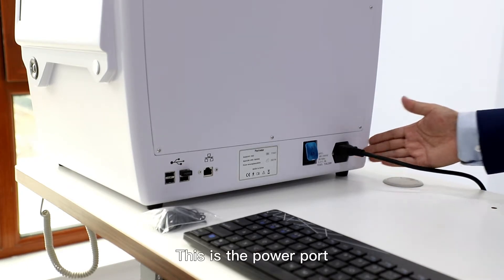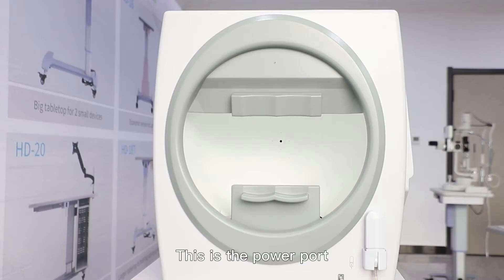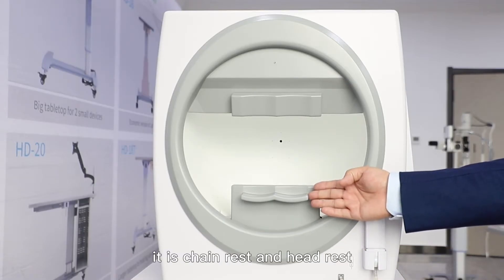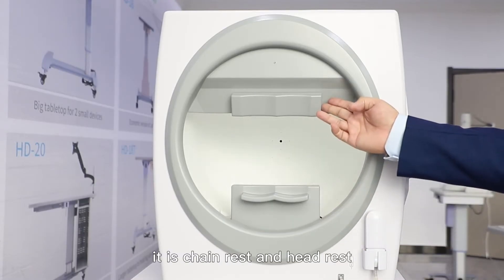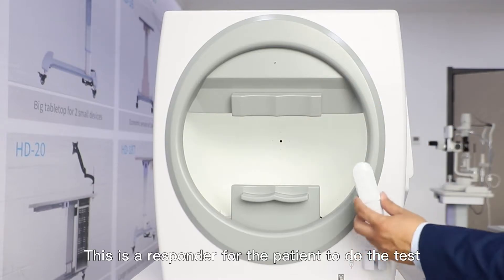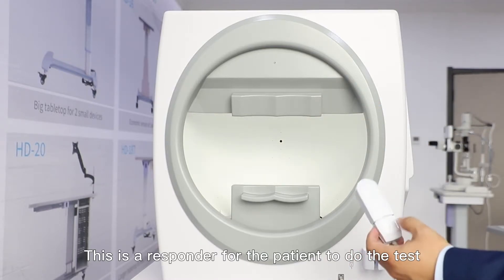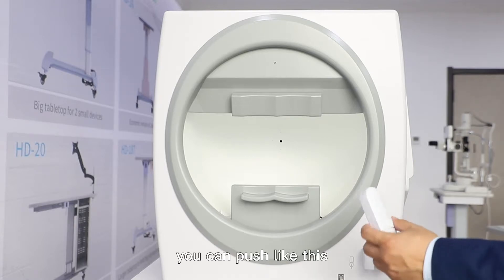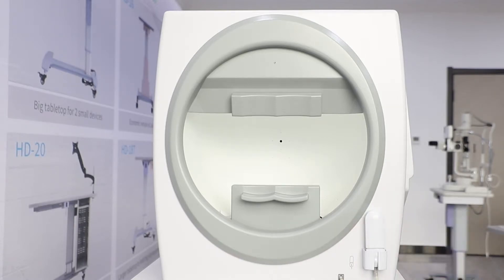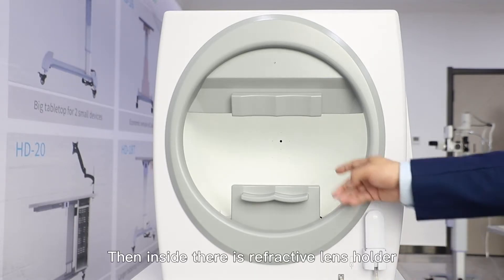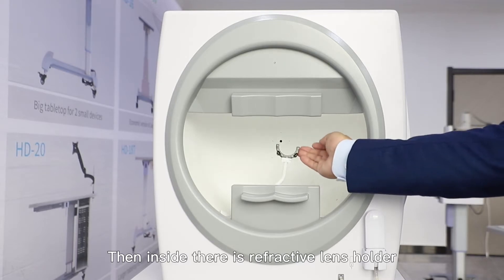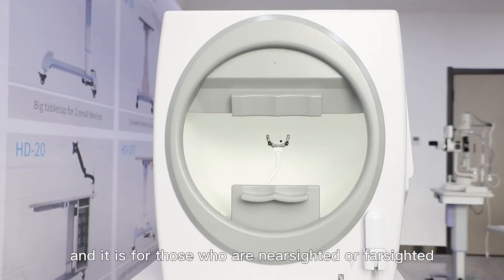This is the power port. On this side are the chinrest and headrest. This is the responder for the patient to do the test, you just push like this. Inside there is a refractive lens holder like this, and it is for those who are nearsighted or farsighted.